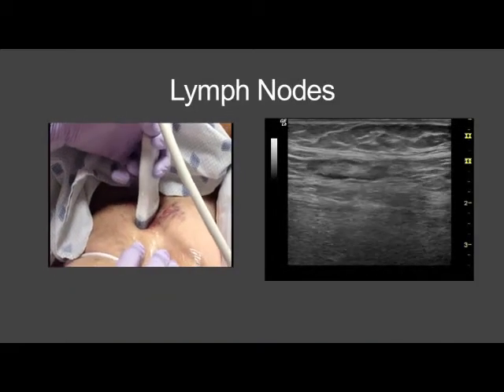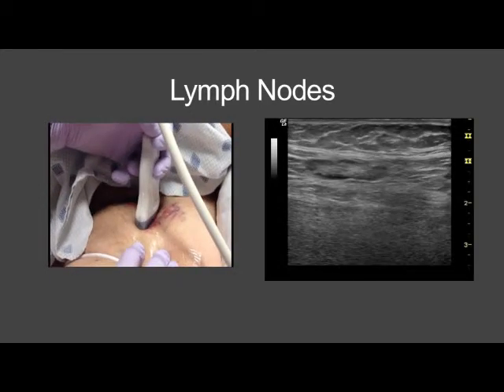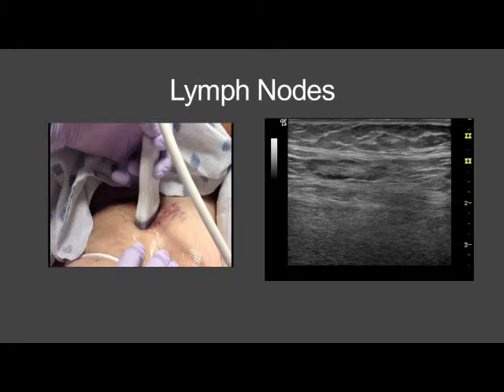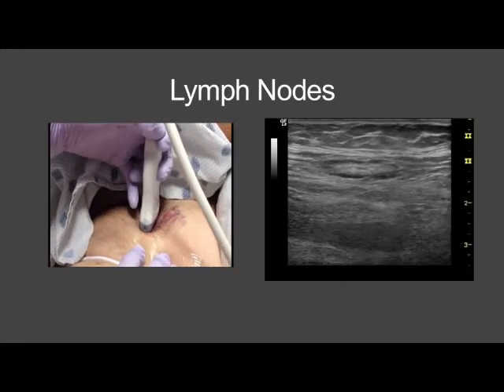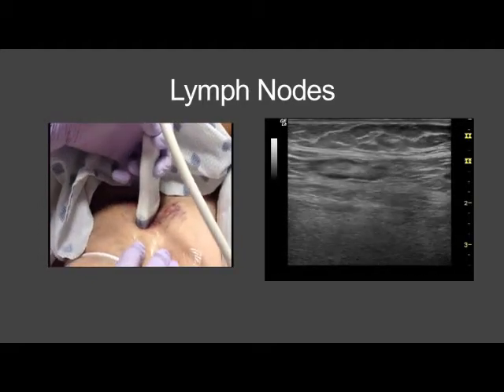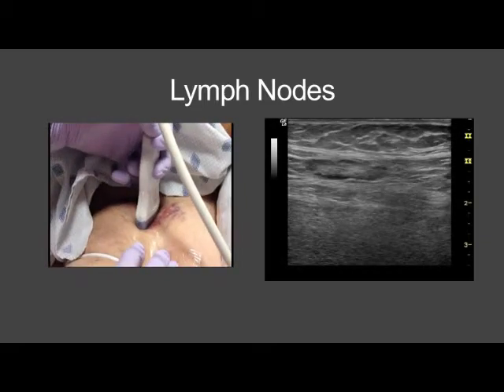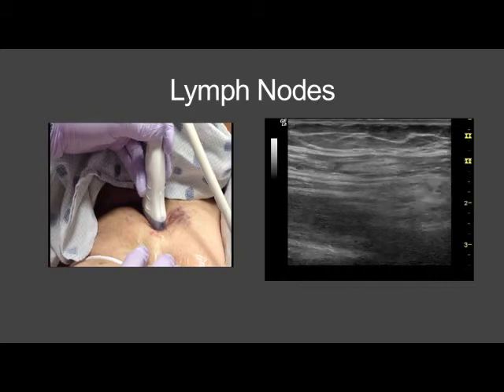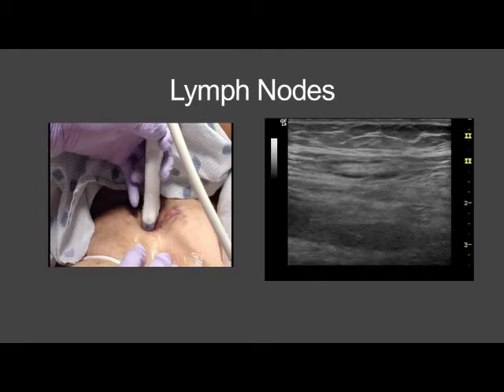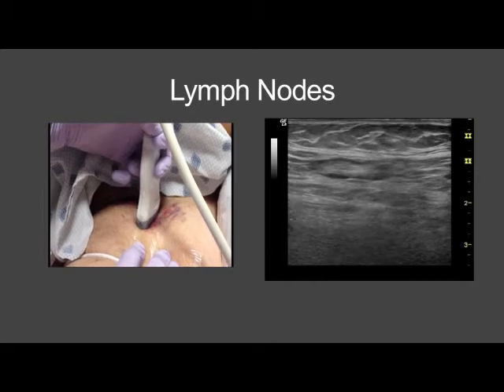However, one of the ways to help differentiate between a lymph node and a DVT is to simply turn your probe 90 degrees with the structure in question in the center of your probe and ultrasound screen to look at it longitudinally. If it is a lymph node, you will see the echogenic material remain circumferential. Additionally, the anechoic structure surrounding it may initially appear to be the lumen of a vessel in a transverse view, but will remain circumferential to the echogenic material when the probe is rotated longitudinally. When the probe is rotated, the anechoic portion of the lymph node does not convert to a linear, tube-like structure as a blood vessel would when viewed longitudinally.